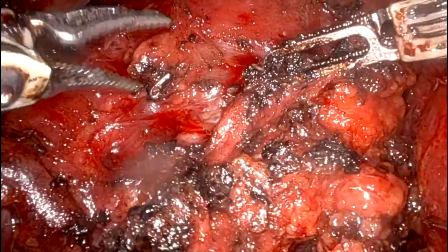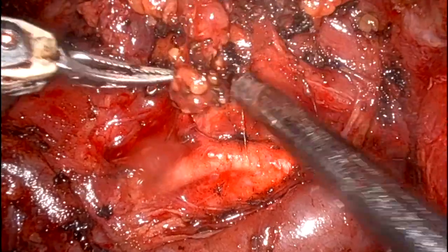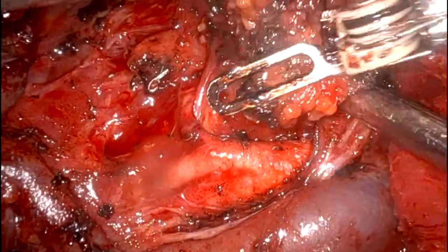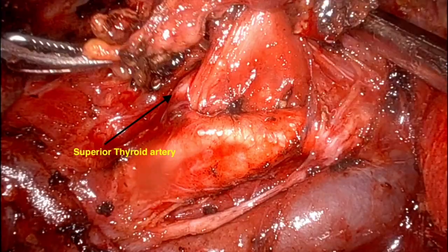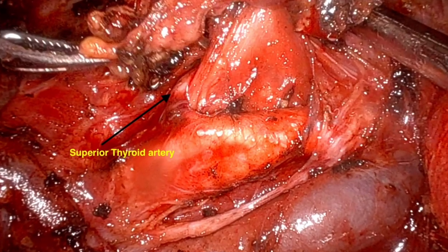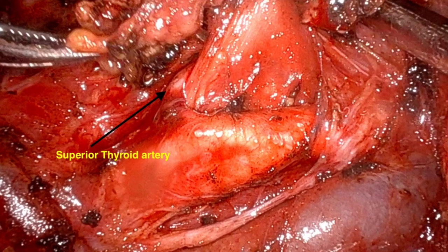Can you see the superior thyroid artery? Yes. So this is the superior thyroid artery, just arising from the carotid, external carotid artery, and this is the artery from which we have anastomosed our flap.